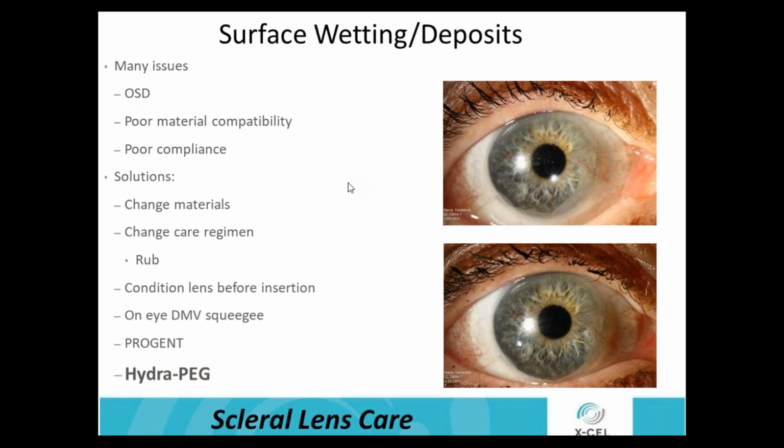Look at their case, look at their utensils to see if the hygiene is what you want. Because if you're chasing your tail on these problems and you haven't asked those questions or seen how hygienic the patient is, then you're not going to know.